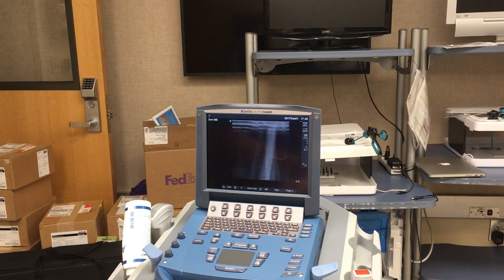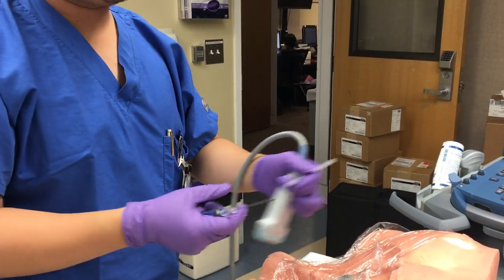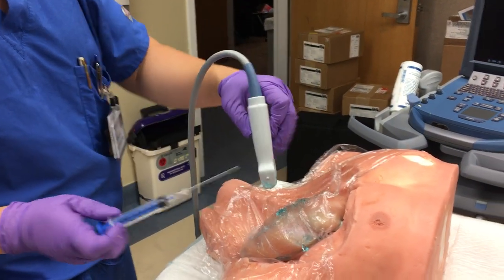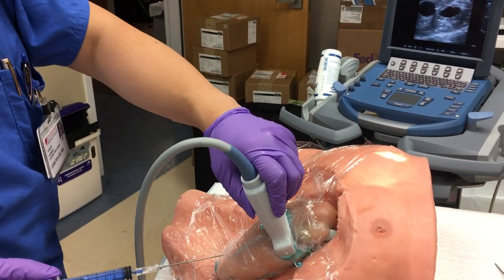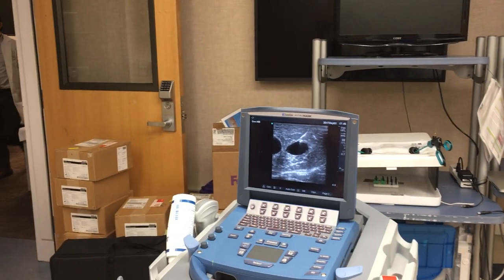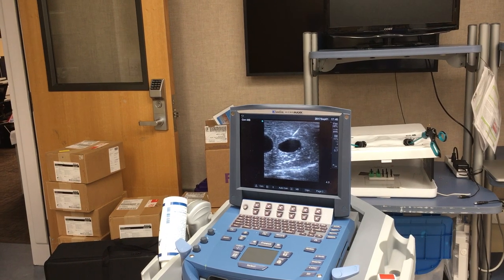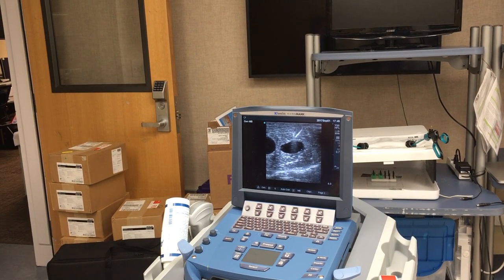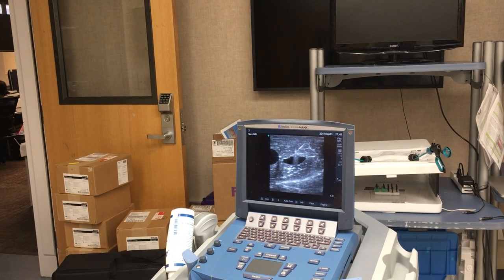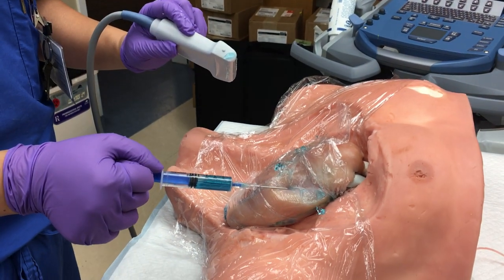Now, to do an ultrasound-guided needle stick, I have a trusty needle for a central line. It's the same exact technique you would use if you're doing a central line on a patient. You line it up right in the middle. Have your needle — as you can see, there's my tip, very well ultrasoundable. I'm pulling back on the syringe but advancing my needle. You can see clearly that I'm going in until you feel a pop — that's the pop through the membrane. And pulling back, I get the blue fluid from the vein.